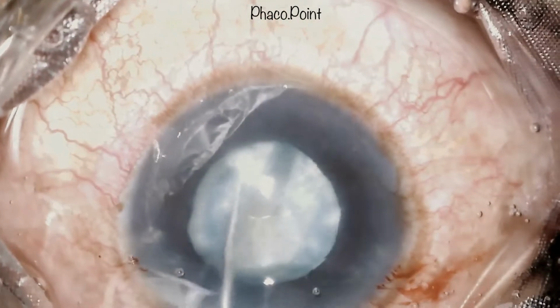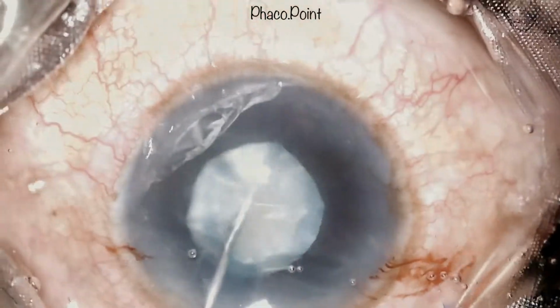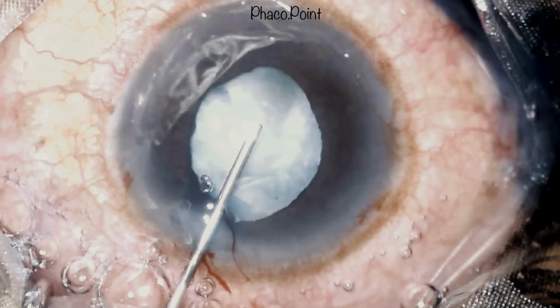Not too much, because I actually have an intumescent cataract and I know this nucleus is likely to turn quite easily. We then introduce a dispersive viscoelastic into the anterior chamber, which serves to protect the corneal endothelium during the phacoemulsification procedure. It's important to use a dispersive viscoelastic because you've got a cornea that's anyway compromised.